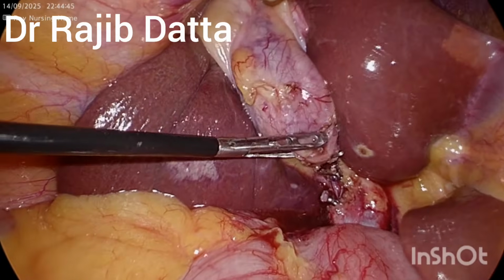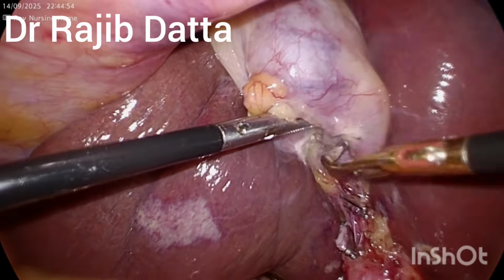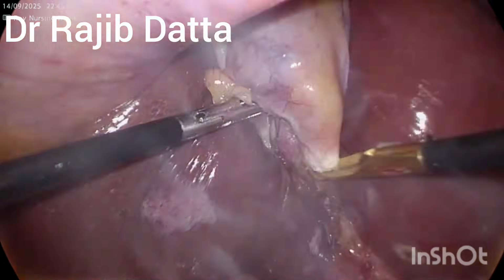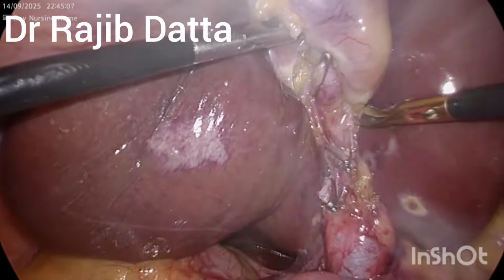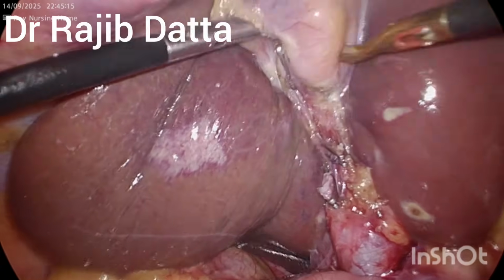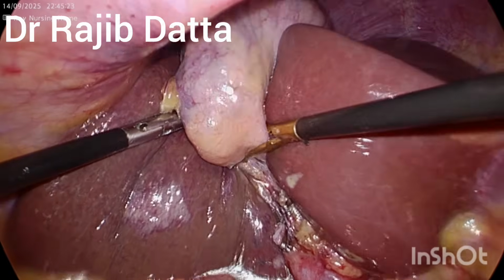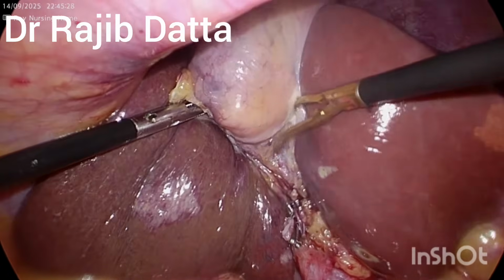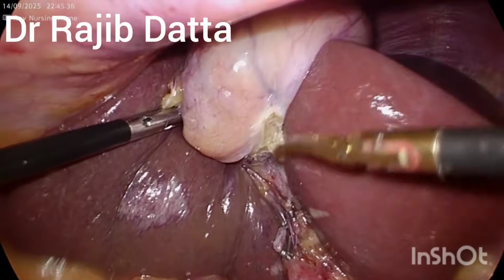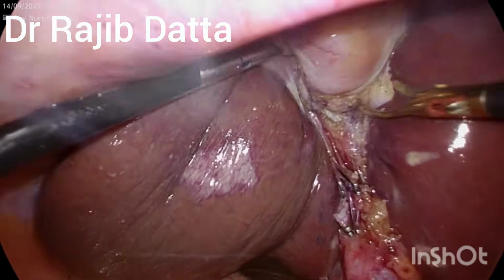Again the traction is changing, and now the gallbladder has to be separated out from the liver bed. As it is an embryological plane, it is usually bloodless, and this bloodless field has to be properly achieved and stick to this plane towards the gallbladder, not towards the liver.